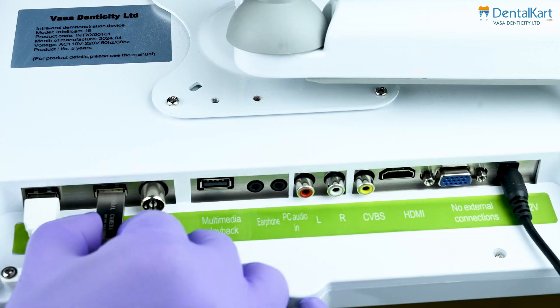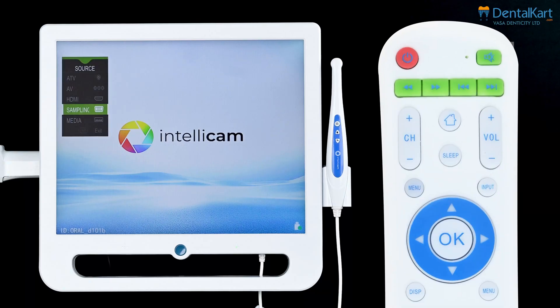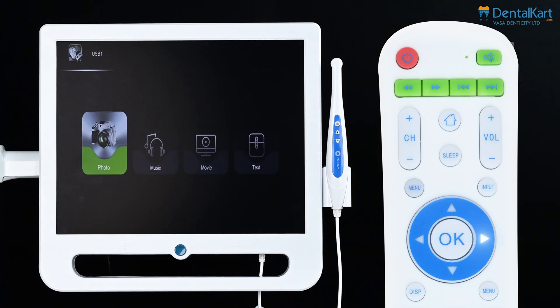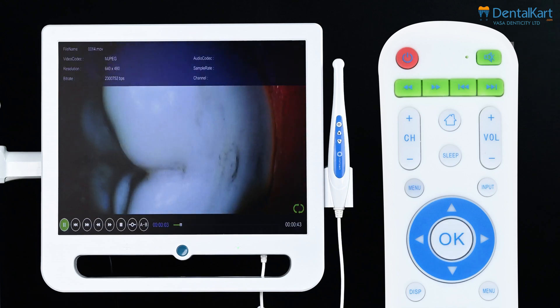To watch a video, switch the pen drive to the multimedia playback slot. Press the input button on the remote control, select media and press OK, then choose the movie option and navigate to the video section to play your recorded videos.